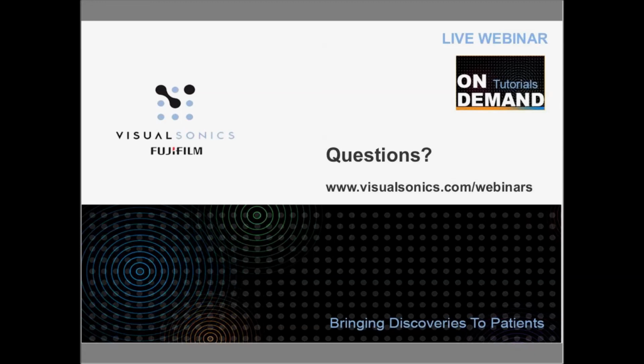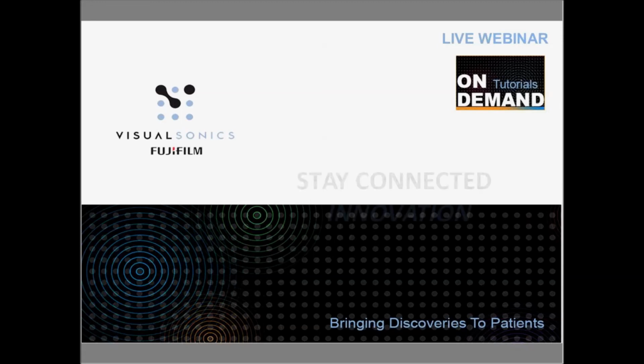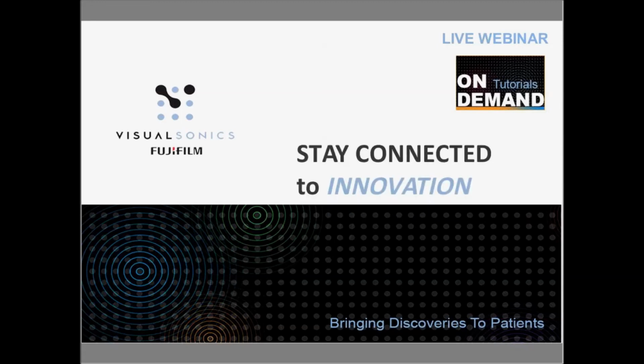Stephen, on the analysis software, what is the use of the reverse strain button? That's number 1. And what does accuracy mean in the analysis window? While Stephen is answering this question, if you can click on the survey link, so that we can get your feedback. Stephen, with respect to the software.